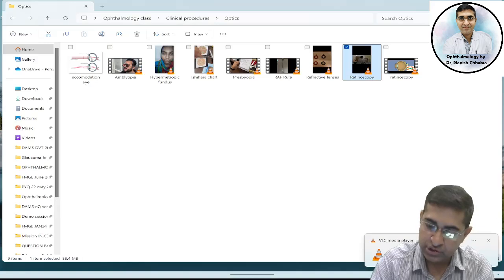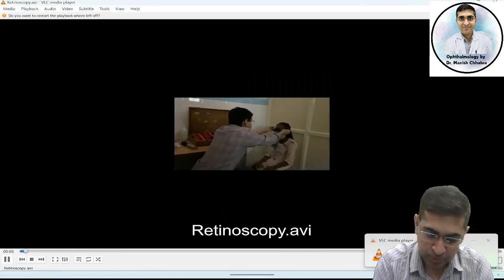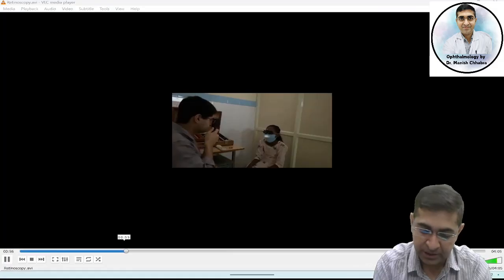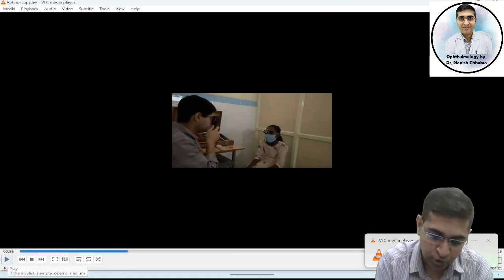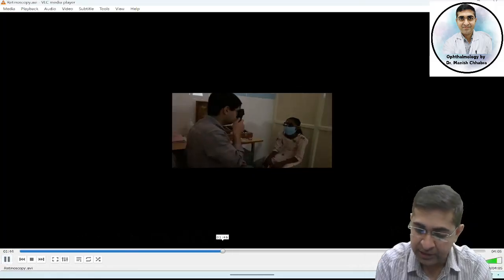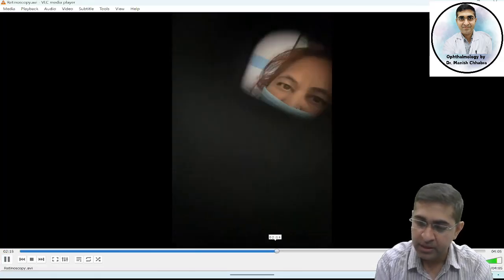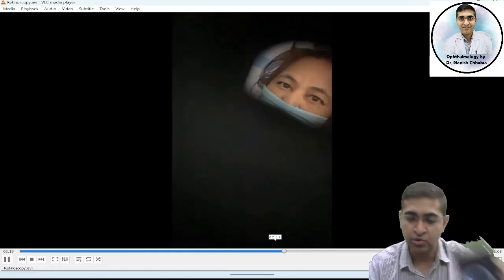Of course I am telling you about retinoscopy. But I told you in the beginning, I want you to have a feeling of sitting with me in my OPD. I told you that we look out for the red reflex. I'm going to show you what we actually see in the eye when we say that okay, this is the red reflex. What I did is I took my retinoscope and I placed my camera behind it, then I did retinoscopy.